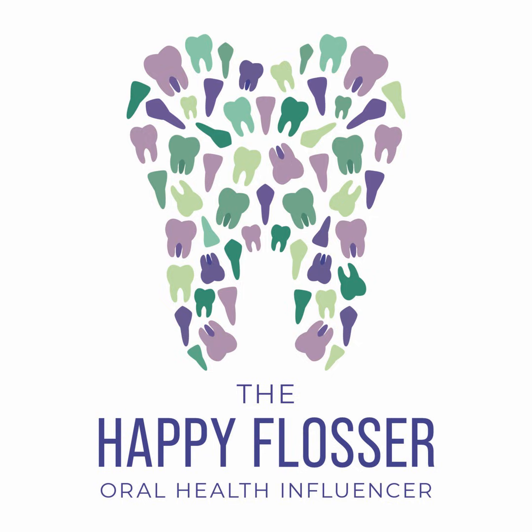It also doesn't reveal the important components of the periodontium as an indication of some of the other contributing factors to early diagnosis of periodontal disease. It certainly doesn't indicate the presence of a periodontal pocket. And you also can't see early crestal bone destruction that's going on in those early furcation areas. You also would not know specifically about mobility or defects, although some root concavities that are significant and severe and some mobility issues do show up on radiographic images.